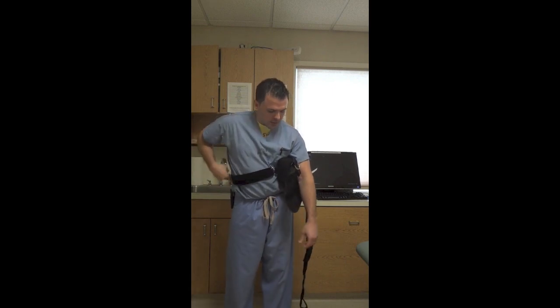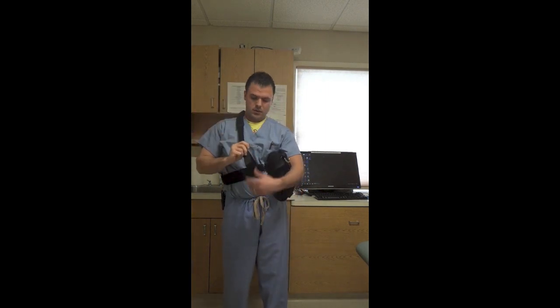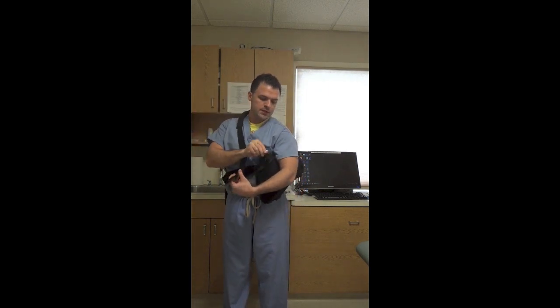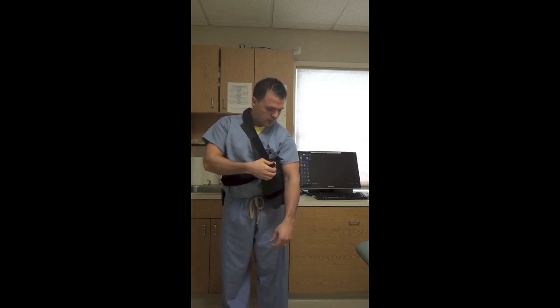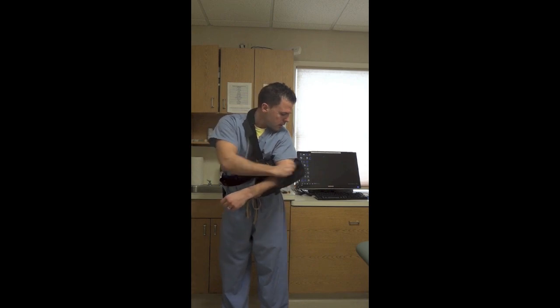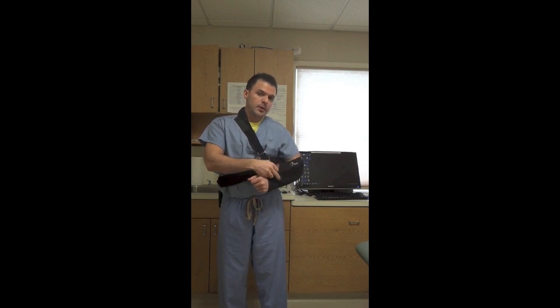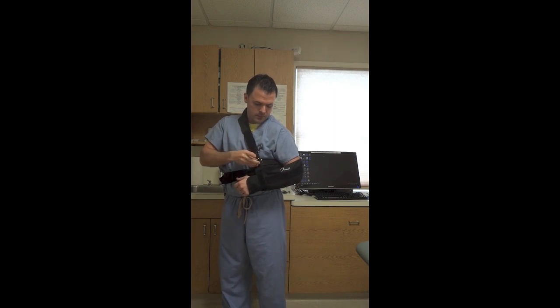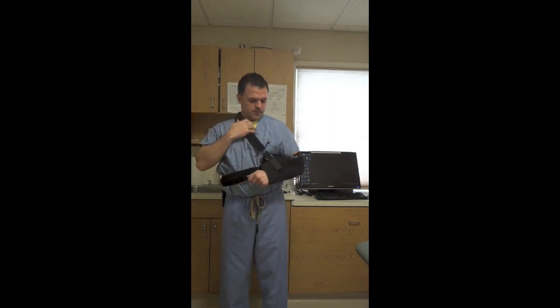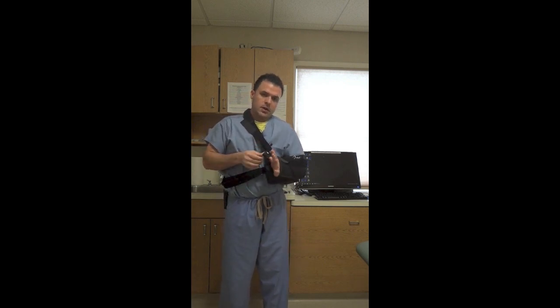This strap goes around the waist. Leaning over, grab the strap around the neck — there are two rings here, and the closest ring is what this strap goes into. Arm in the sling, bring your elbow back; it will hurt to some degree with any kind of movement in the shoulder. Slide your elbow back, the strap goes back through the ring, and you're properly positioned. The thumb should go through this cloth ring right here.